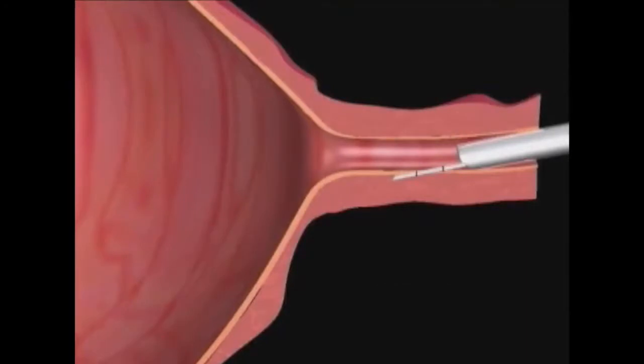Second, while maintaining this depth, reduce the needle angle to zero degrees. Third, advance the needle to the second circumferential mark, or approximately another half centimeter, creating a tunnel in the submucosal space.